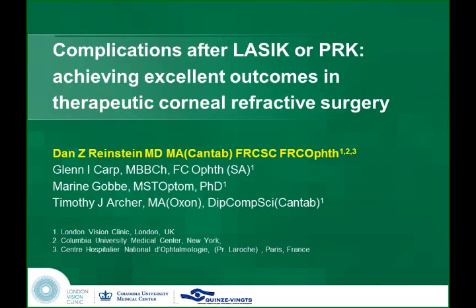But hopefully you understand the basis of how to use these tools, and particularly you become a little bit more aware of the centration differences between Wavefront-guided and topography-guided. Angle kappa is the number one element that you have to know a patient has before you decide on a repair profile.